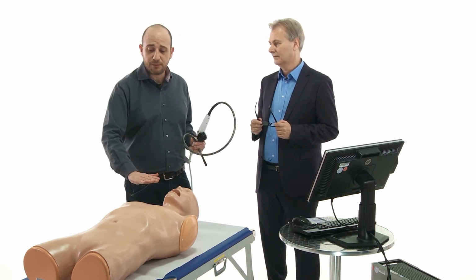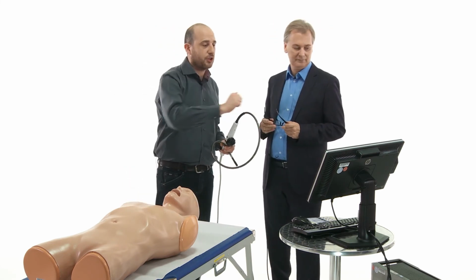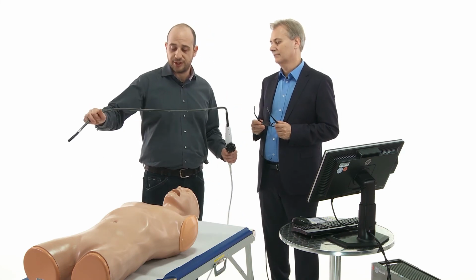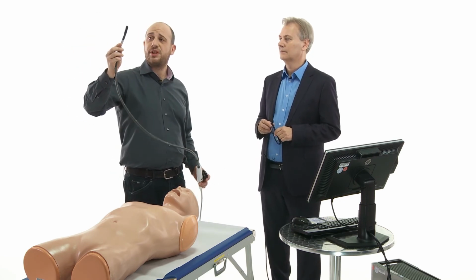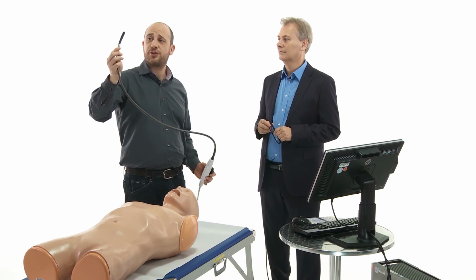Normally my patients are in the operating room in this position, and our monitor, the ultrasound machine, is there. So what I do, I take the probe. We can move the tip of the probe in many directions. We can do anteflexion, retroflexion, and we can move the probe to the right and left side.